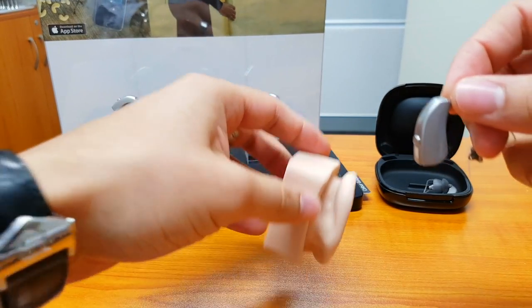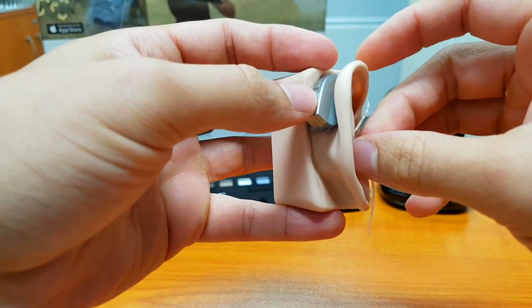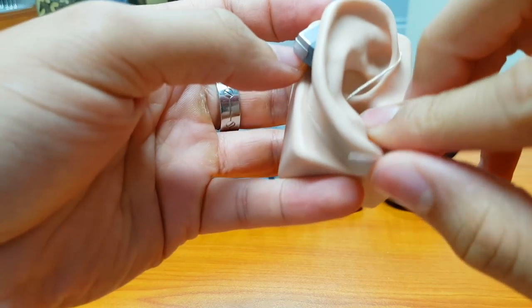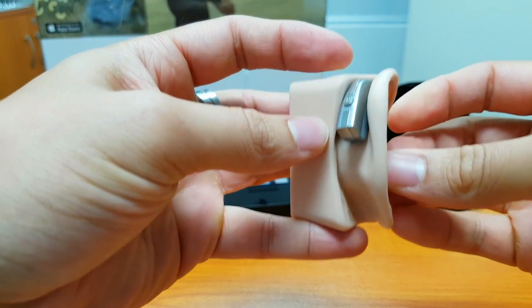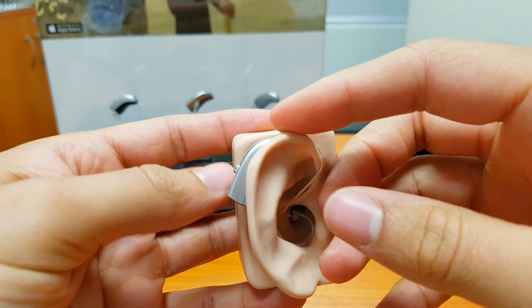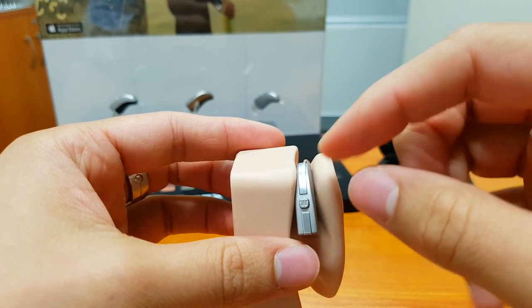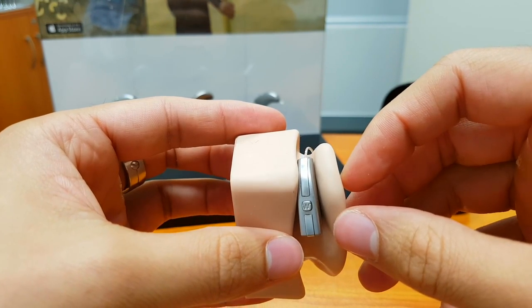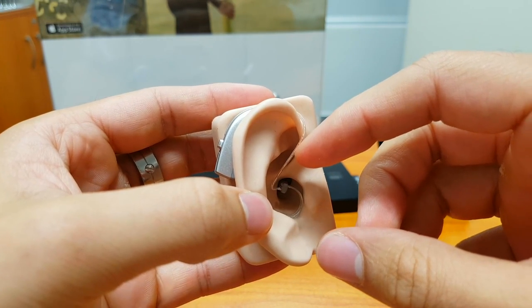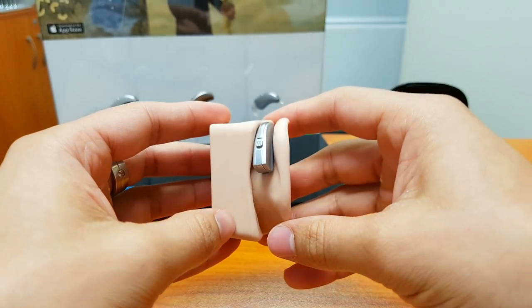Placing this on the dummy, the hearing aid sits maybe halfway down the ear, yet we still have access to the button at the back. We've got that thin wire coming down with the speaker unit sitting deep inside the ear canal.